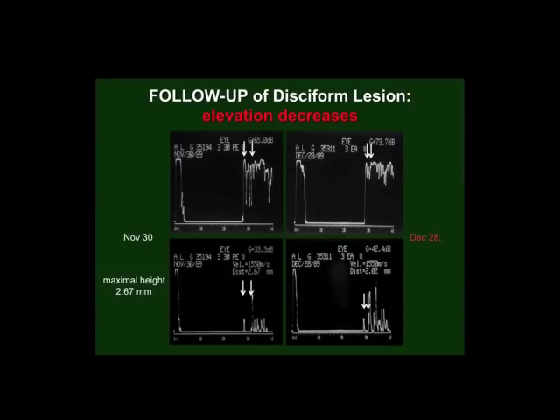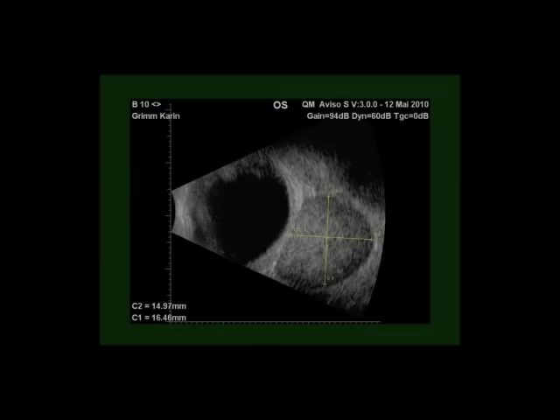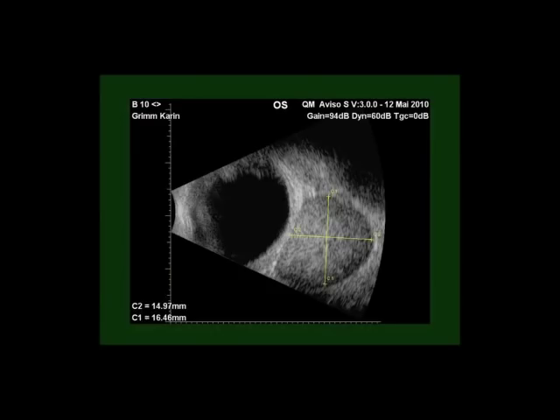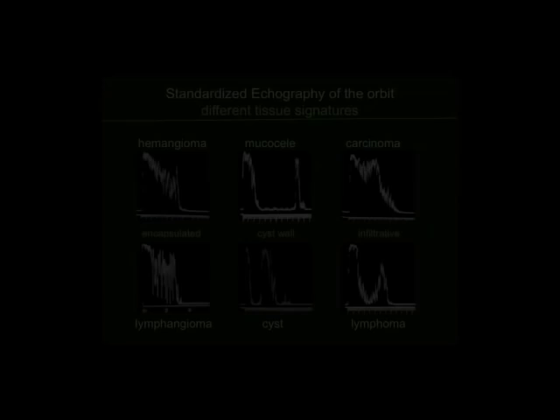A good example is the orbit. Unless you want to send any patient with orbital symptoms right away to an orbital surgeon, you need to know what the underlying cause is — whether it's proptosis, redness of the eye, pain, or swelling of the lids. The diagnosis is very important to know what to do next. Here is a B-scan showing an orbital tumor obtained with the Aviso-S — a nice display of the shape of the tumor in the retrobulbar space — but the B-scan does not tell you what kind of tumor it is. For this we need A-scan.